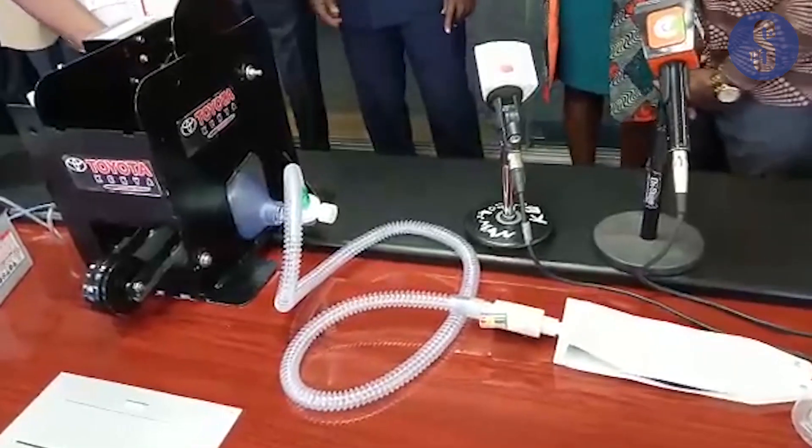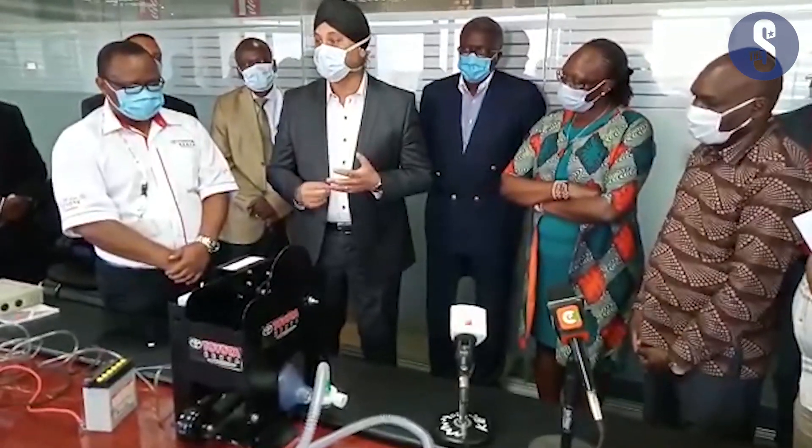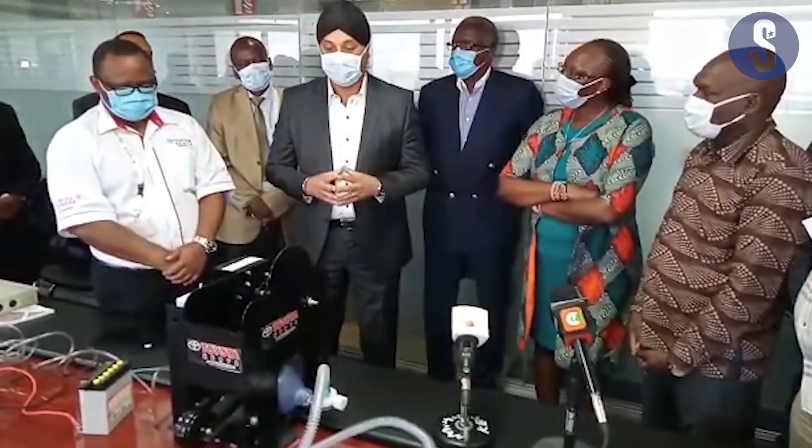We can regulate the breaths that are actually required using the mechanism. It can use battery as well as electricity — from smaller batteries like a motorcycle battery up to a larger battery.